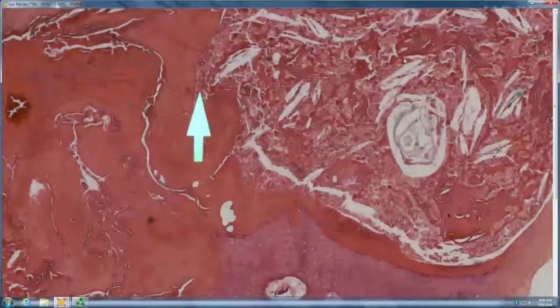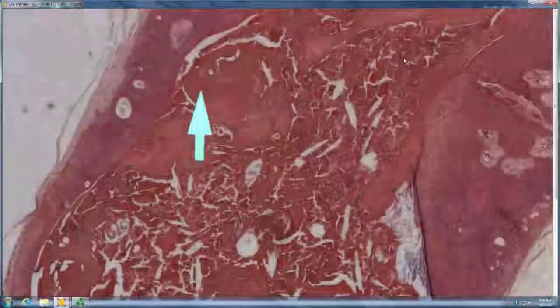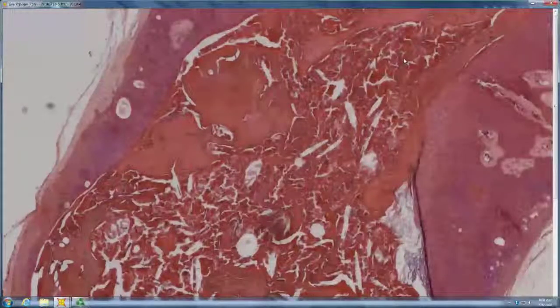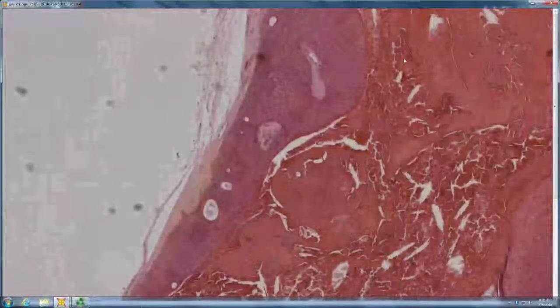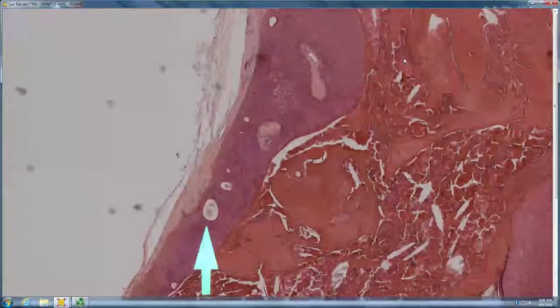It's a little hard. So if you had to describe it, with this central cavity, you'd call it a cystic structure, right? And what's the differentiation here where it has a horn cyst? Infundibular.